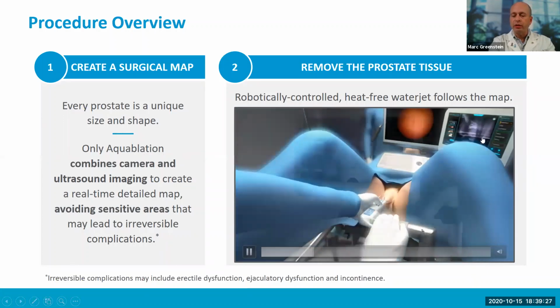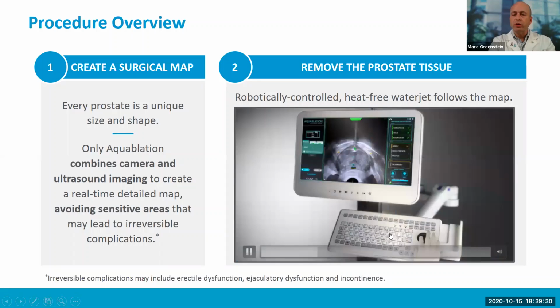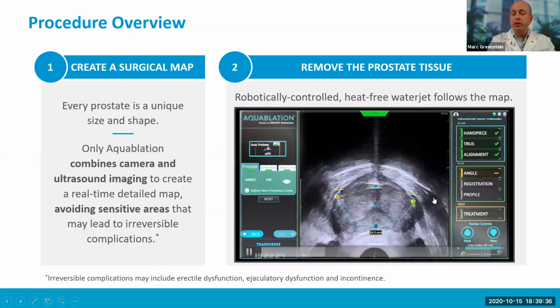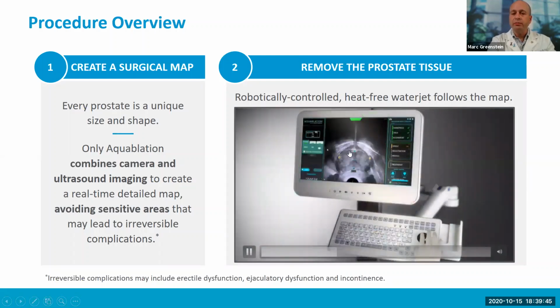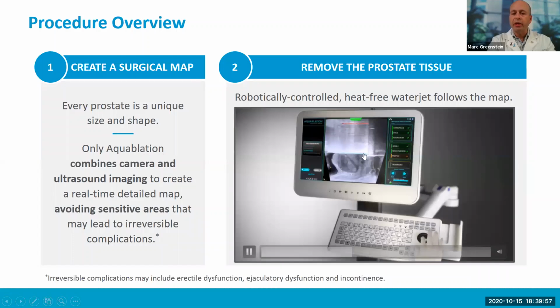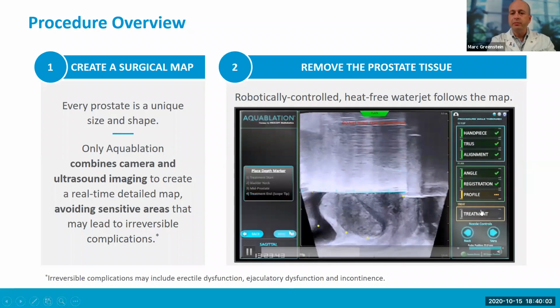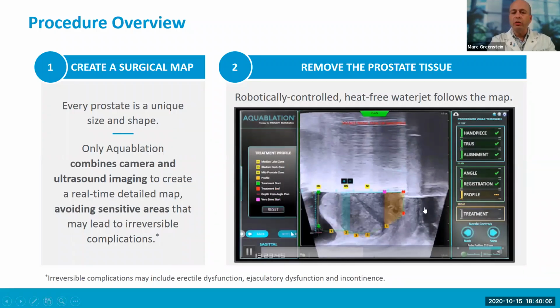And here's my ultrasound up here in the right corner. The camera goes in, as you just saw, into the penis and then into the bladder. And then I start playing basically a computer program, and I start mapping the prostate. So this is the prostate here. I tell the device where to go. I make sure that all points are looking good. We test the water jet. We tell the computer program where the camera is, so that it's, like I told you, GPS guided. And then once we're a go, we turn on the water jet therapy.